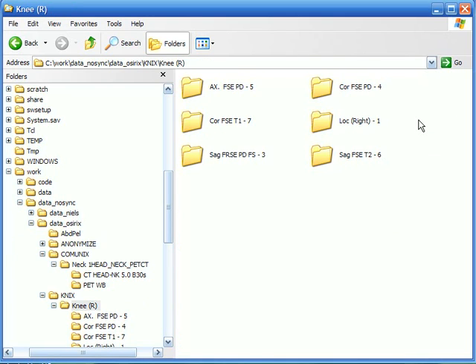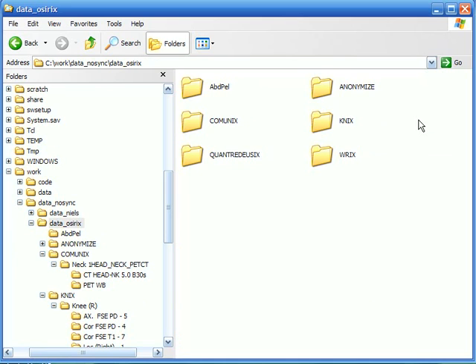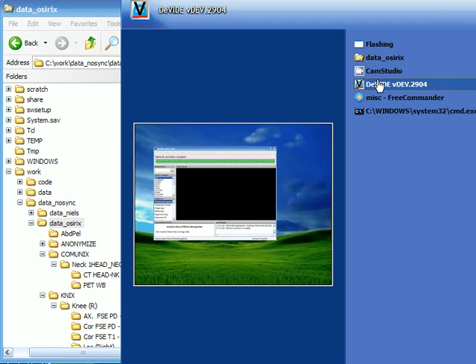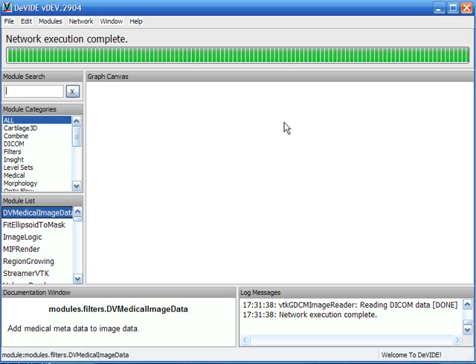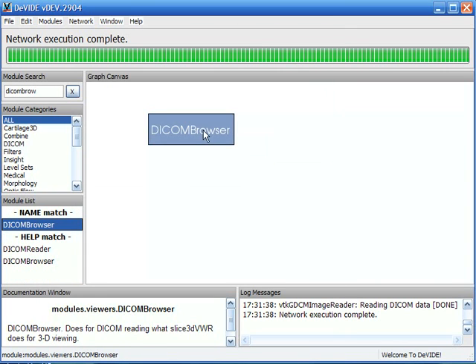It can be quite hard to find the volume that you would like to process so that's why I've made the DICOM browser in DeVIDE. So let's instantiate this module. There it is.